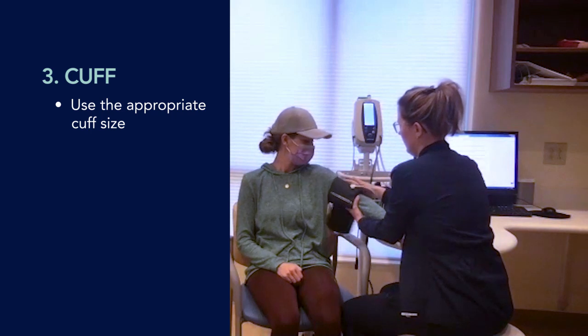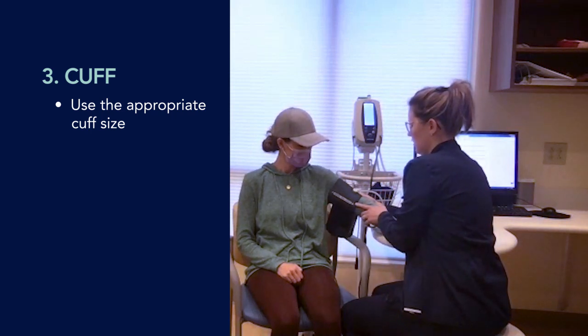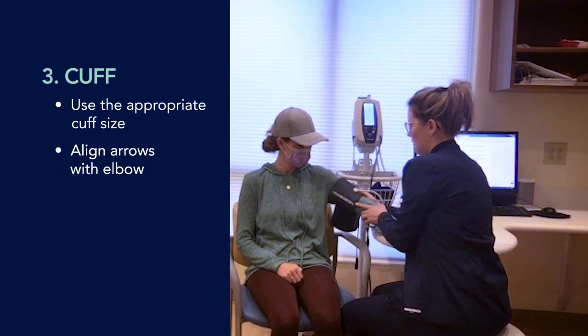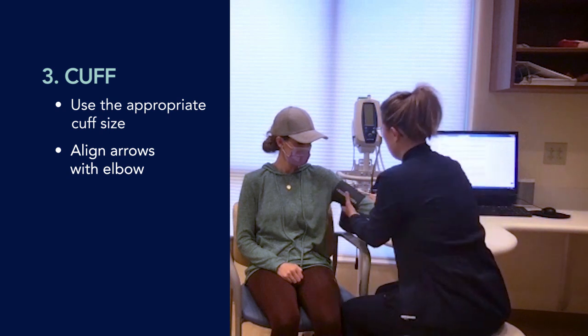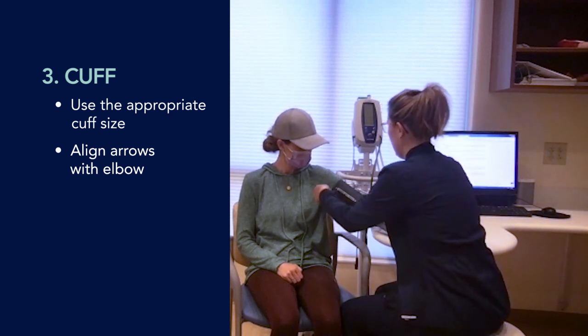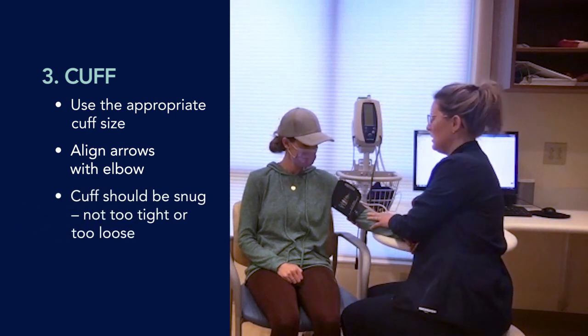When we apply the cuff, there is a marking on it. We want to make sure that the arrow is falling in line with the crook of your elbow. And when we do apply it, we want to make sure it's not too tight or too loose fitting, because that can alter the blood pressure reading.